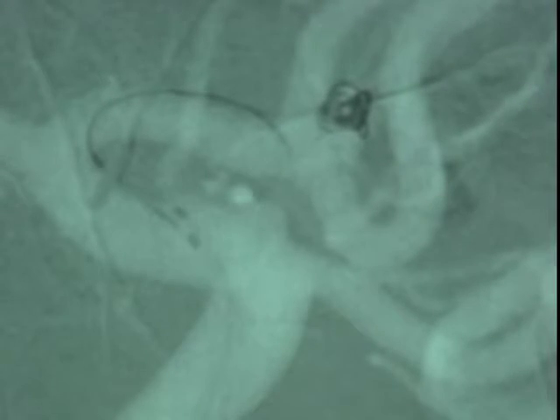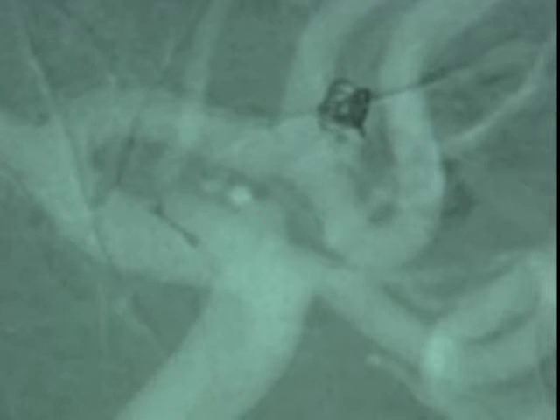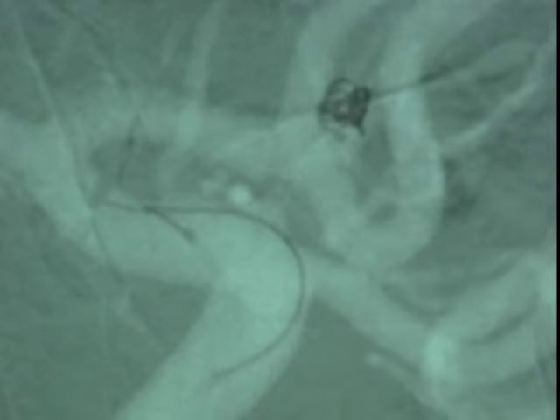Therefore, during this coiling procedure, we will have 2 catheters within the aneurysm at the same time and will be advancing coils through both catheters. Here the second catheter tip is placed into the aneurysm and the micro wire is removed. A coil is now placed through this second catheter and into the aneurysm.